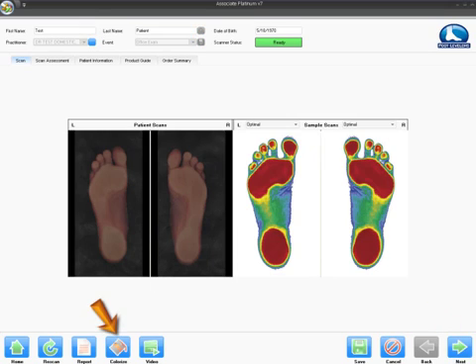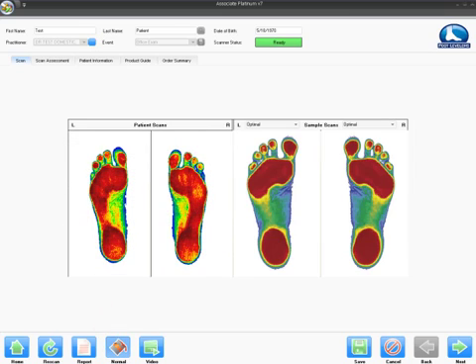Now click Colorize. The first area will be to point out the optimal scan and explain that the associate scanner reads pressure. When it is colorized, the software reads the areas where the most blanching occurs and puts it into a red color. This indicates the area where your patient bears their weight.